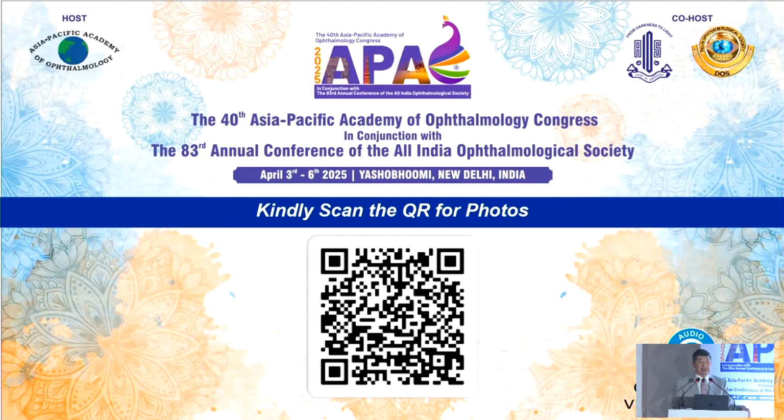But I use this on every case now with a CTR. It's so slick, and it's such a neat idea.